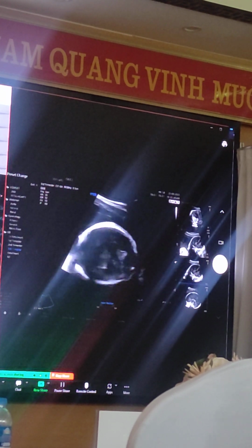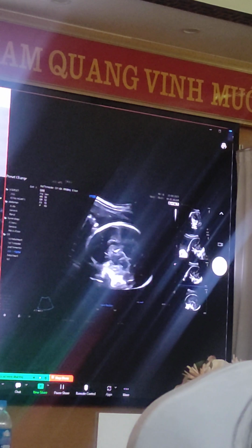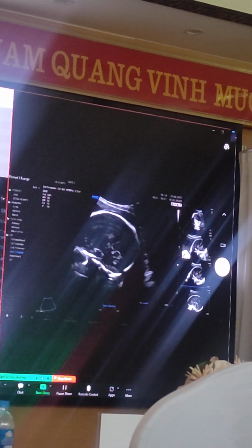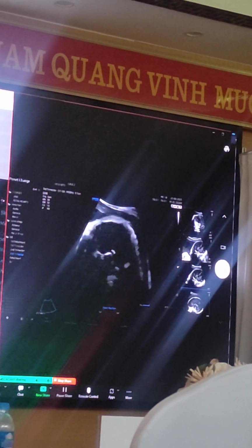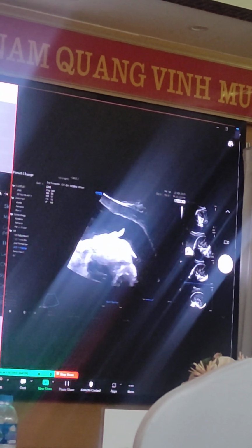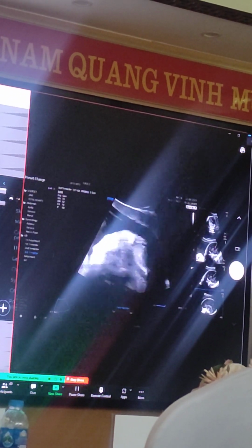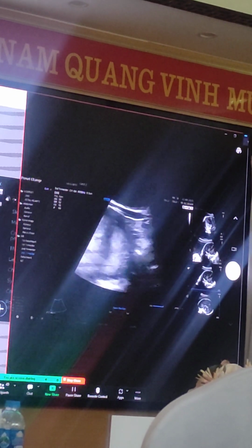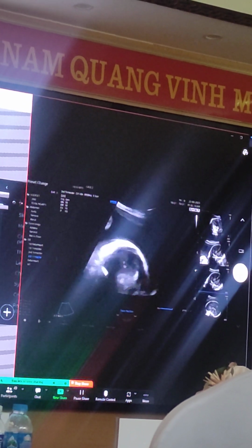The cerebellum and the vermis, again, if we were still thinking of CHARGE, would be an important thing to check, because cerebellar hypoplasia is often part of CHARGE. If you still think about CHARGE, you will look at the ears, and this is a normal shape of the external ear on this side. But you need to look on both sides, and that's often challenging because of the position of these babies.